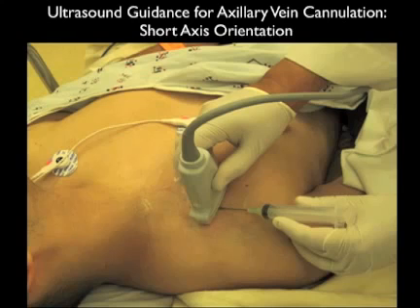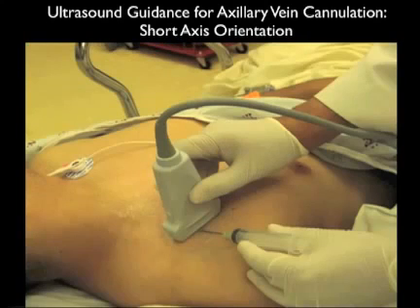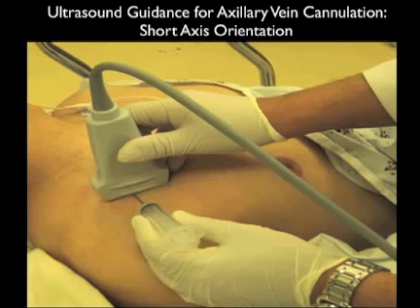Here's a few pictures showing the orientation of the probe and the placement of the probe for cannulation of the axillary vein in a short axis orientation. Notice here that we have the probe in an up and down configuration with the indicator dot towards the patient's right shoulder or superior. Notice we're placing the needle roughly at about the midway point underneath the probe.